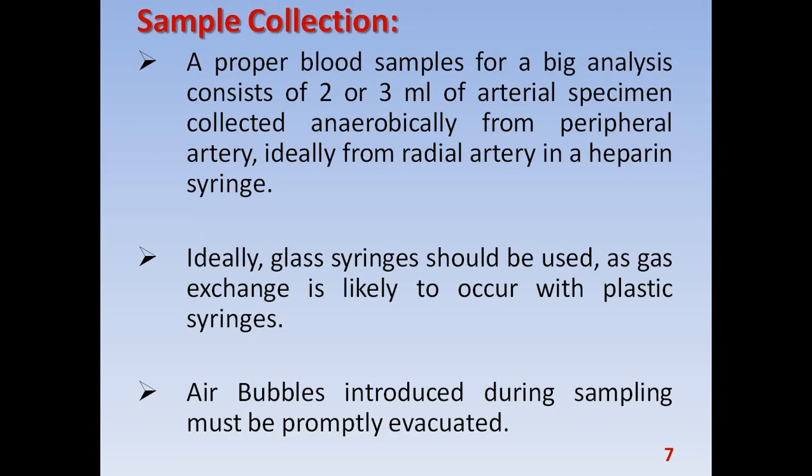First, we have to elevate the hand, and the patient is asked to clench the fist for 30 seconds. Then after that we will apply pressure over the ulnar and the radial arteries to occlude them both. Now the hand is still elevated, and the clenched hand is slowly opened, and we can see the pale coloration of the hand. That is called blanch, the pallor of the hand. The hand will not be pink in color, it will be pale.